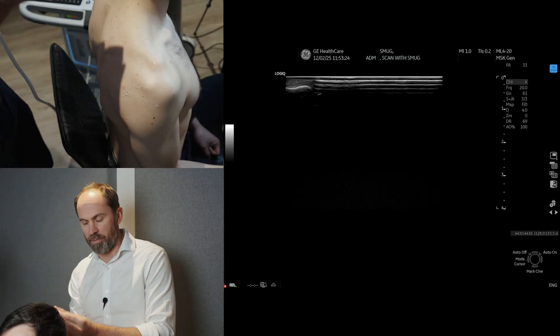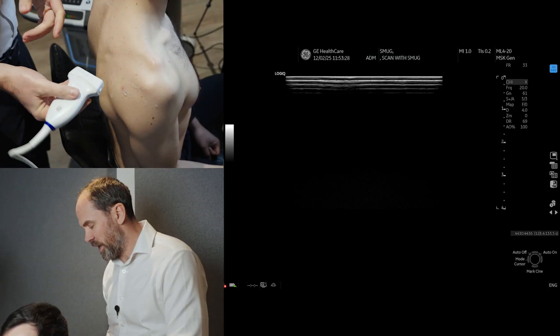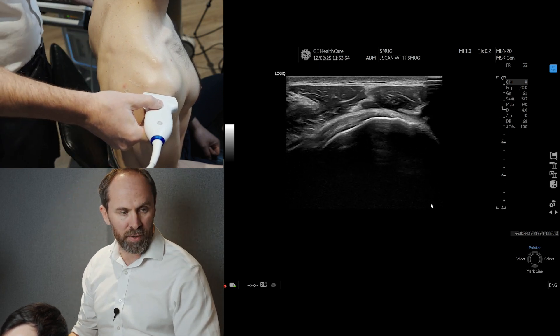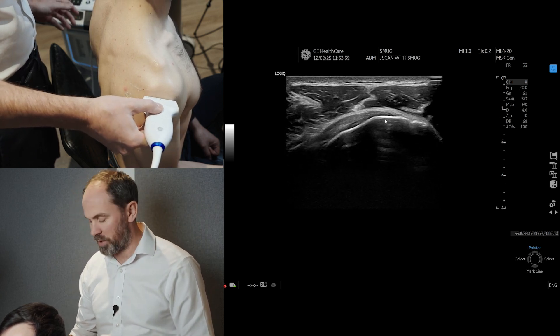I've just got the patient in neutral. Left side of the probe is left side of the screen for me. What I would advise — and you'll see it on the probe position — is to actually start quite laterally. To start with, find the humerus, which we can see there. It's round, it's easy. You can obviously heel and toe in that position.